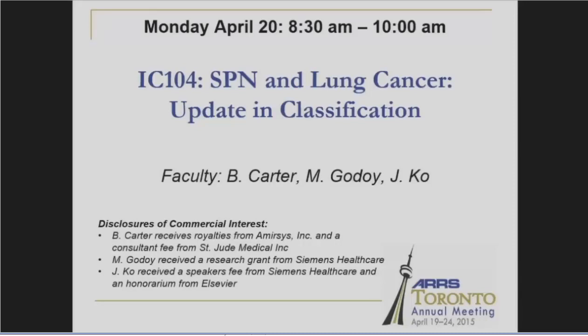I think one point that I would make is that these nodules, the malignant ones, are going to start at some point. So we do see some nodules, 3 millimeters, that turn out to be cancers later on, either solid or ground glass. So we use the size threshold, but there will be those that are smaller than those thresholds. So one thing that I do is, when we're talking about follow-up, we say according to guidelines from the Fleischner Society or according to guidelines from the American College of Radiology. So that is not your management. This is accepted medical management based on the knowledge we have at this point.